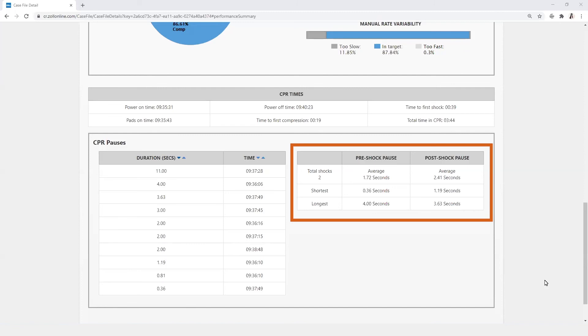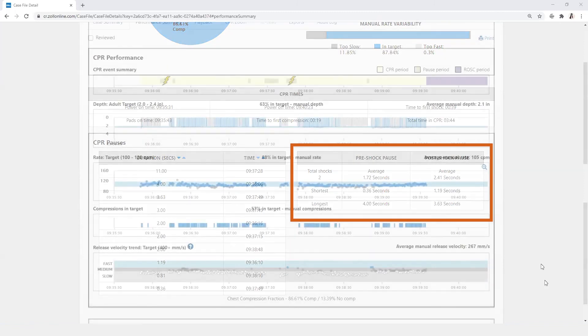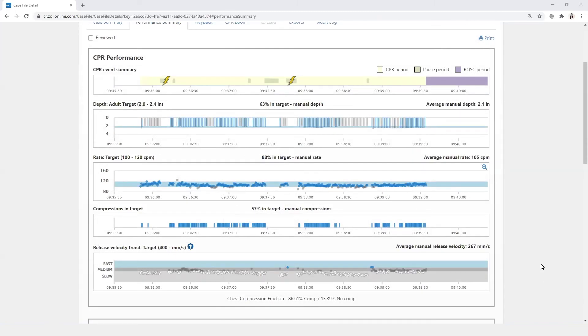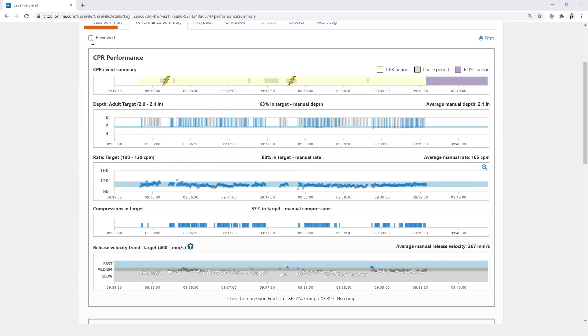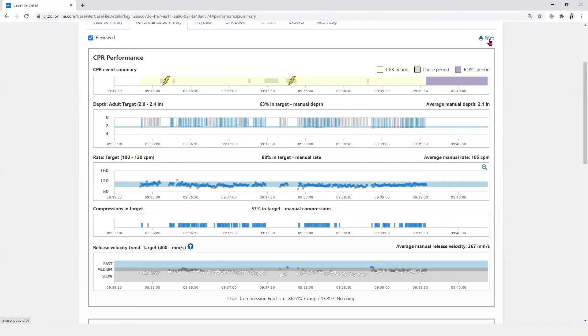The user can hover over any portion of the display to view information about an individual section. Once a case has been reviewed for performance, it can be marked as reviewed by checking the reviewed box. Performance summaries can be printed and saved as a PDF by selecting the print icon.